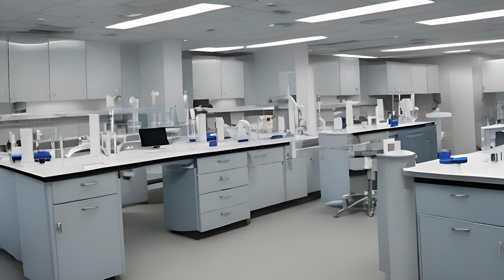It is common to have your patient hold pressure while you label the tubes in front of them. I personally prefer that method because once I wrap somebody's arm up, they often take that as an indication that they're done and it's time for them to go. So they're going to lift the arm up on the chair, stand up, and start walking out and be on their way.